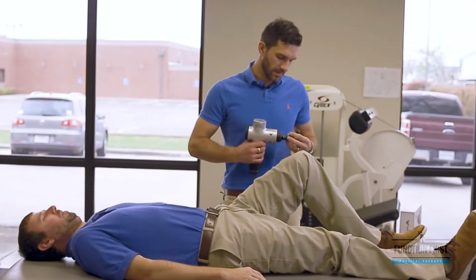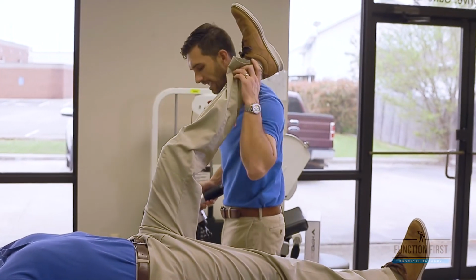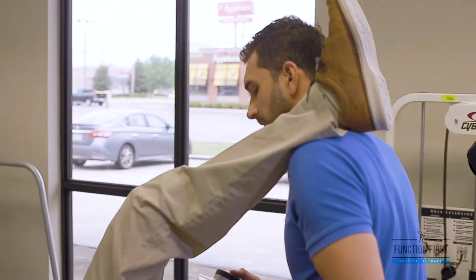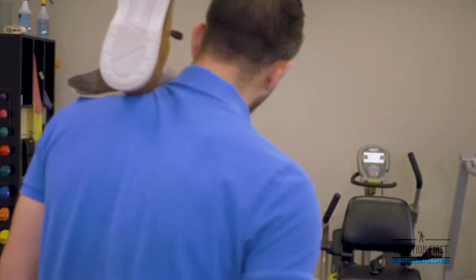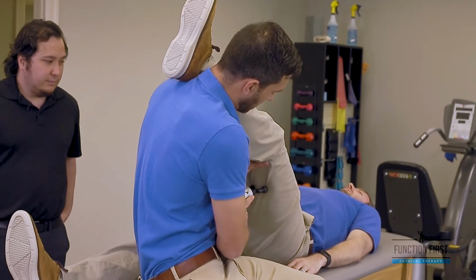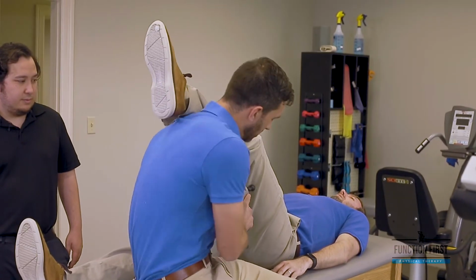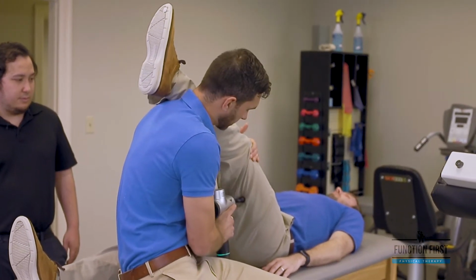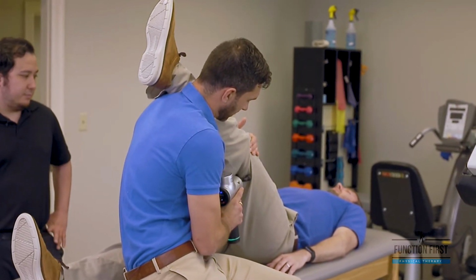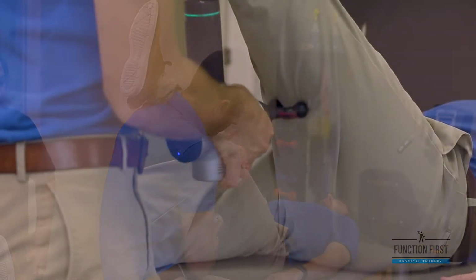Fork head. It's good for the gastrocs, good for the hamstrings, and you can go through some active release or some contract relax, some reciprocal inhibition stretches here. And that fork really kind of gets in between the heads of the different hamstring muscles, and you can dig in, get it to relax a little bit.